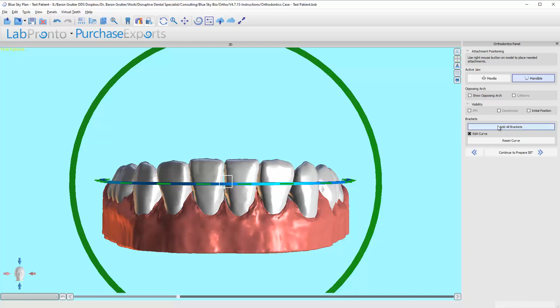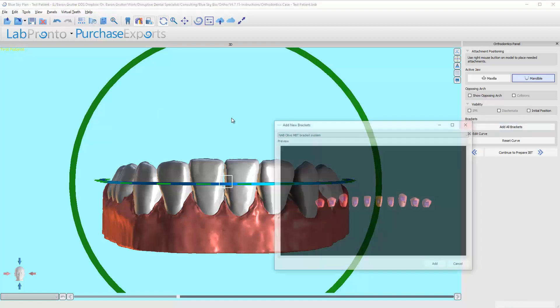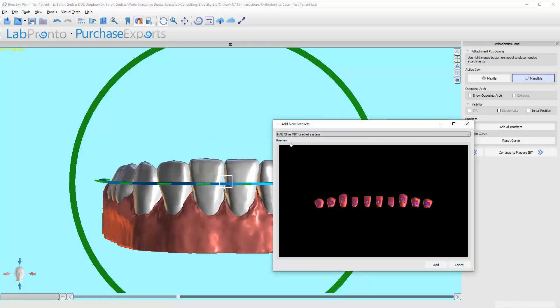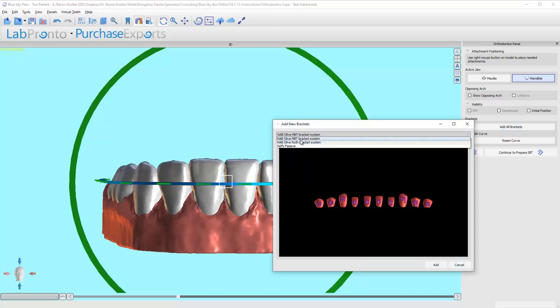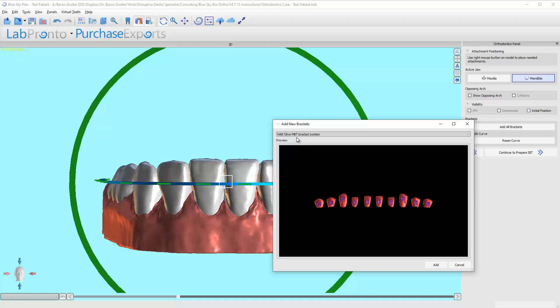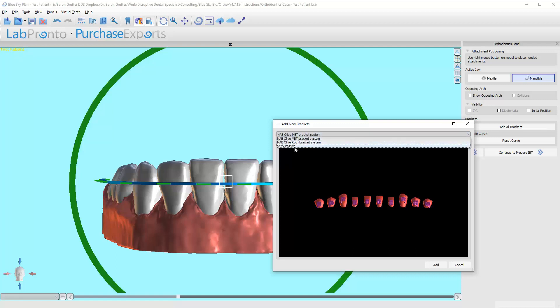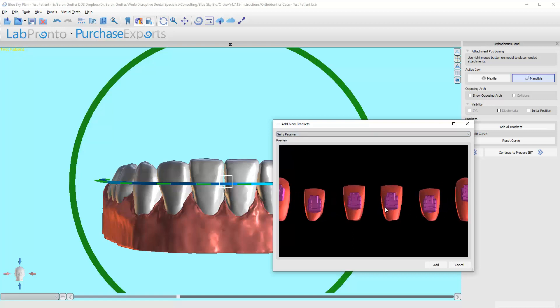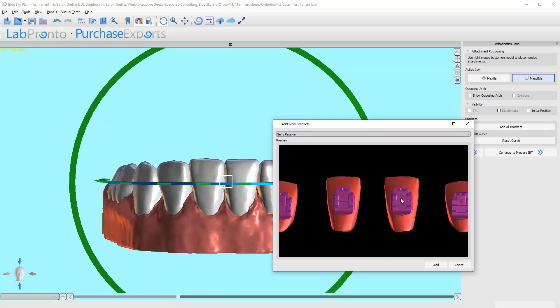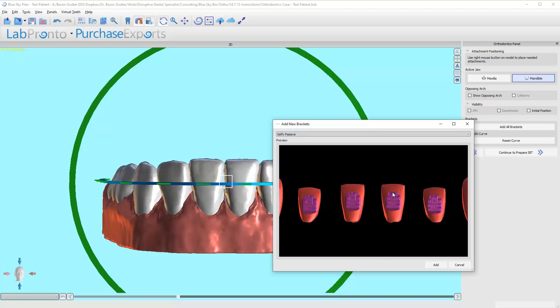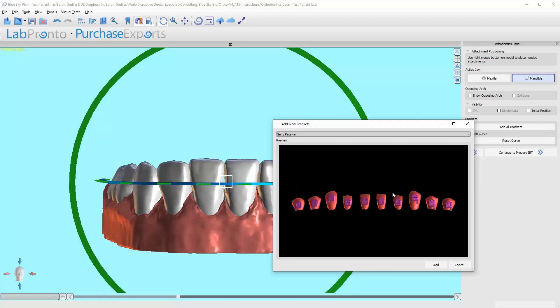I'm going to click on add all brackets. Now I'm going to click on whichever bracket system I want. Right now we just have three lines of brackets. This is a traditional metal bracket, there's two different prescriptions, the MBT, the Roth, and then this is a self-ligating bracket. It has a little door that slides in and it's a passive self-ligating.